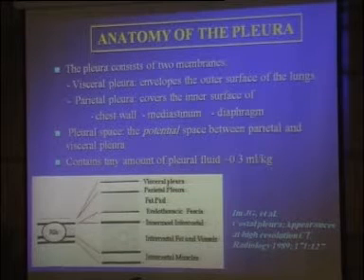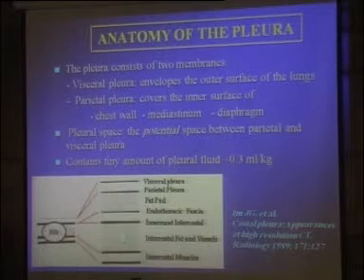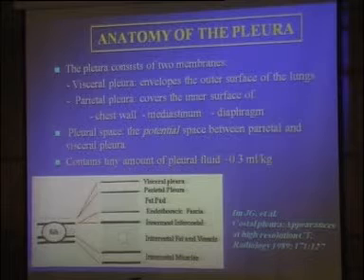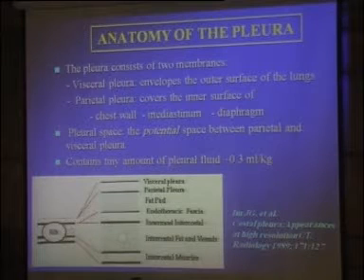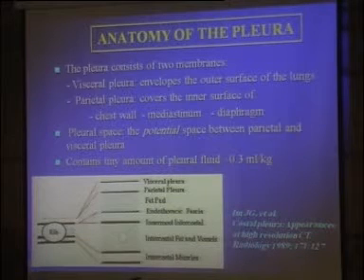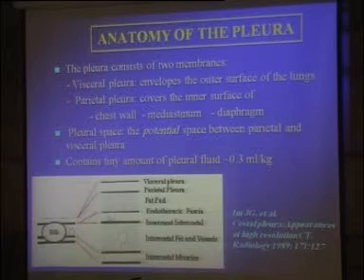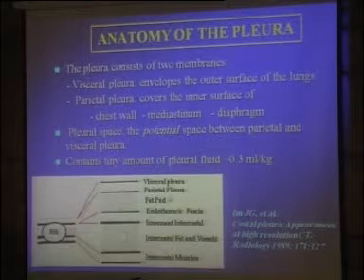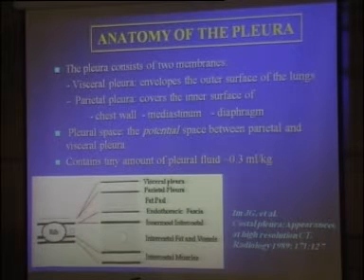And the argument from our colleague surgeons, for instance, in a young patient presenting a recurrent spontaneous pneumothorax, when you decide to create a pleurodesis in a young patient. Usually the surgeon tells you, but Philippe, in 20 years, if this young guy develops lung cancer, and if I have to perform lobectomy or pneumonectomy, it will be impossible due to your talc poudrage at the present day. It's not a valid argument, you know, because a good surgeon, a modern surgeon, is going to cut at this level. And in any case, there is no problem concerning a talc poudrage with inflammation created at this level and the future potential lung resection. Then you can rule out this surgical argument, which is very important.